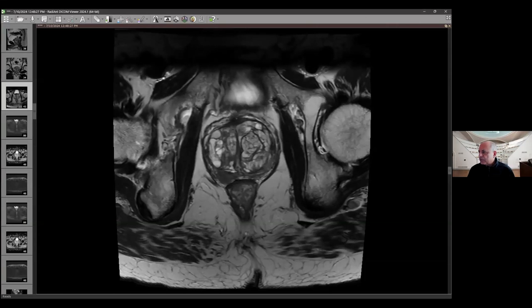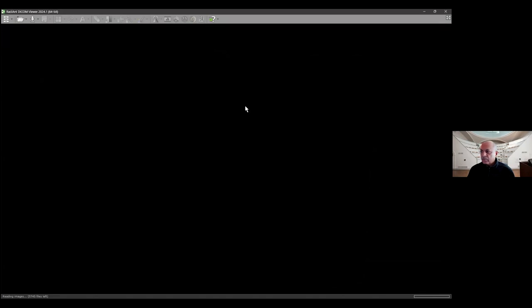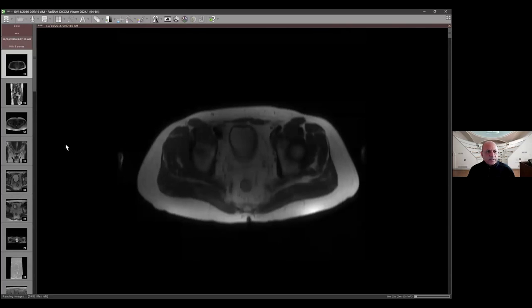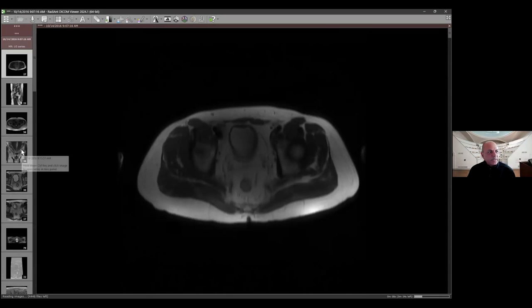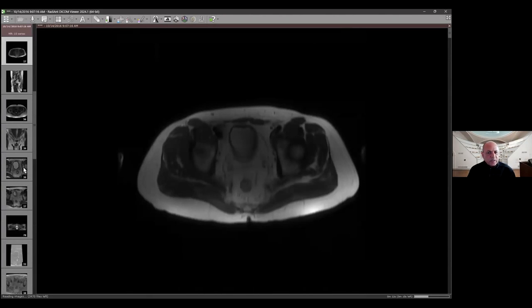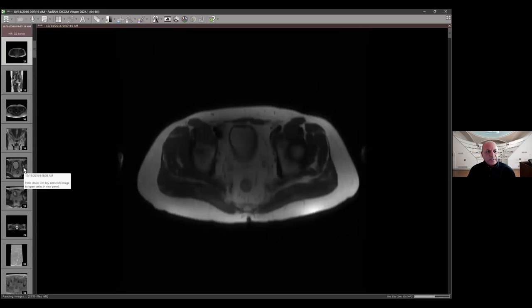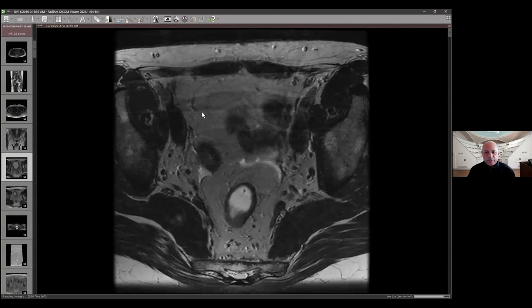Moving on to the next patient — a 65-year-old with a PSA of 20.9, and also an elevated PSA density above 0.15. The urologist who did the digital rectal exam felt something bilaterally but was not sure, and given the high PSA and high PSA density, they wanted to get the MRI first.